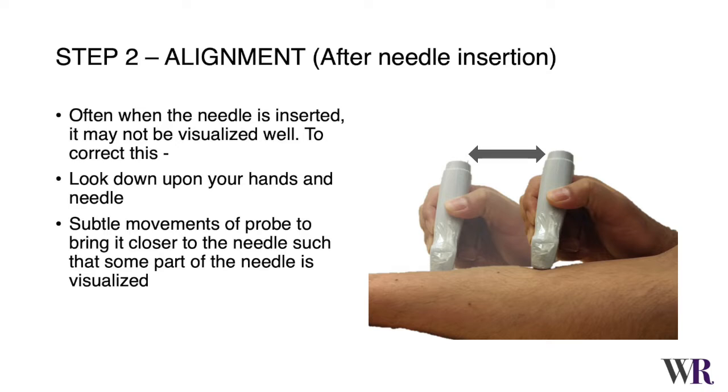The next step is alignment. In this, the probe is brought closer to the needle. This is typically done after the needle insertion. Often, once the needle is inserted, it may not be visualized appropriately.